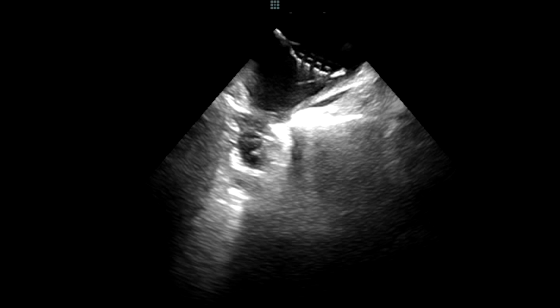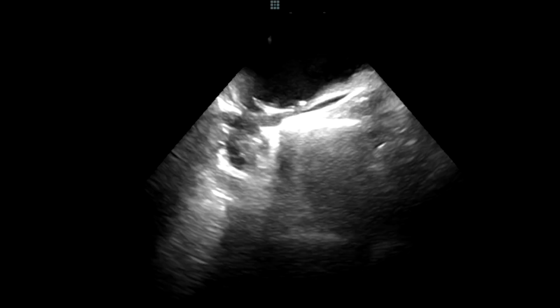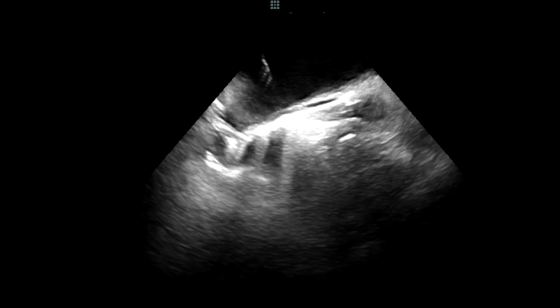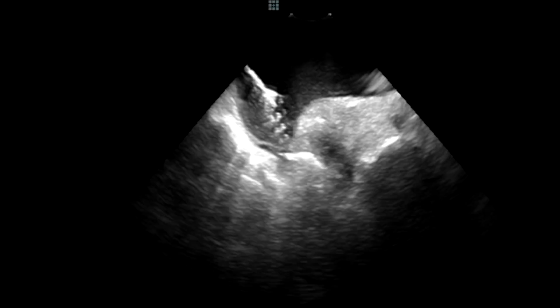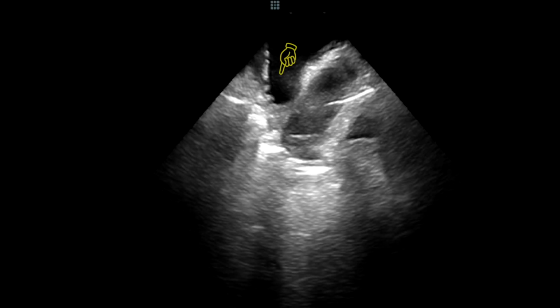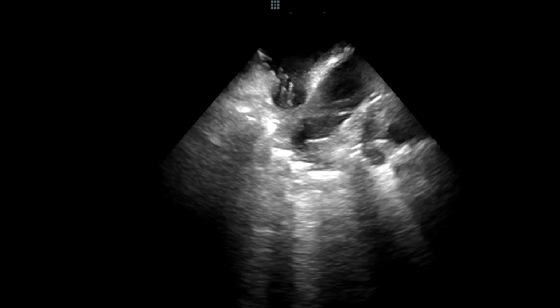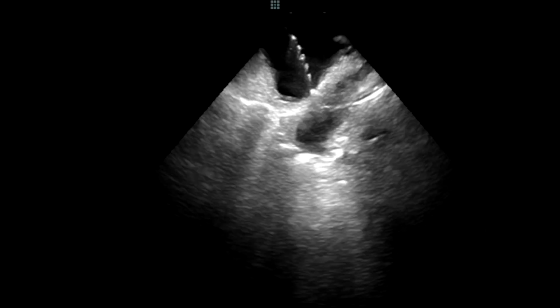Here we clock our ICE catheter. We see the right inferior pulmonary vein, and we advance our HD Grid inside it. After we get the geometry and activation of the right inferior pulmonary vein, if we perform a little bit of clockwise rotation of the ICE, we are able to see the right superior pulmonary vein, and that is a pulmonary artery. So we do the same maneuver with the grid and advance the grid inside the right superior pulmonary vein.